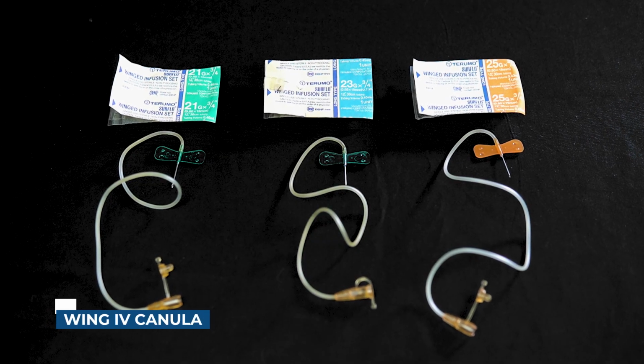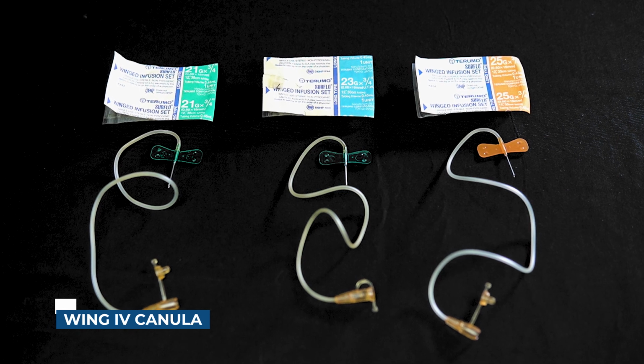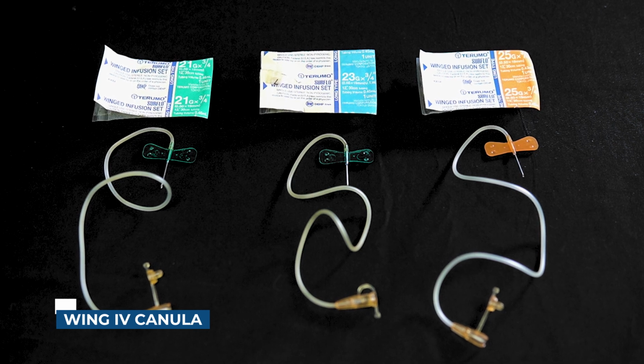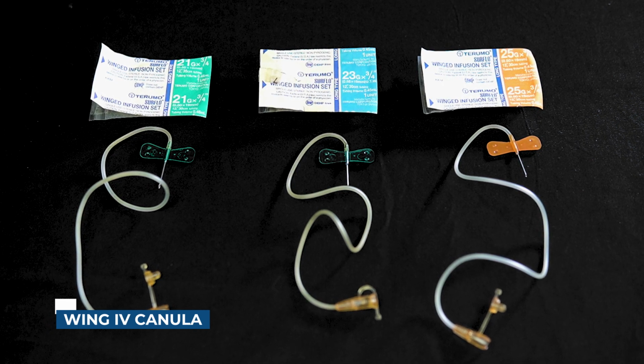Wing needle or butterfly needle is used for venipuncture, especially for very superficial veins, such as hand or scalp veins. It consists of a hypodermic needle, wings, flexible transparent tubing, often 20 to 35 cm long, and a connector. The connector attaches to another device such as a syringe and vacuum tube. When compared to a simple straight needle, a butterfly needle can sit on more body surface, therefore tolerates more patient movement.